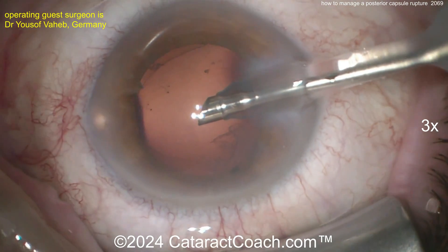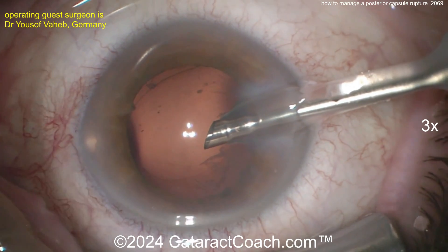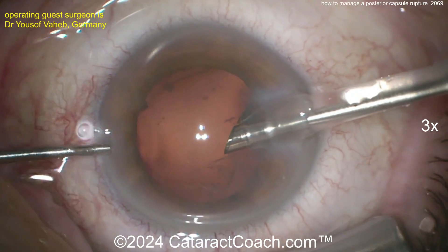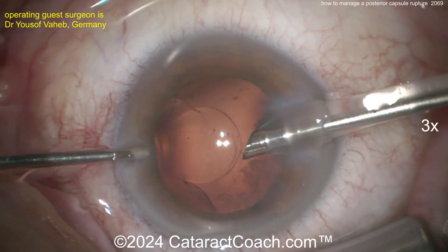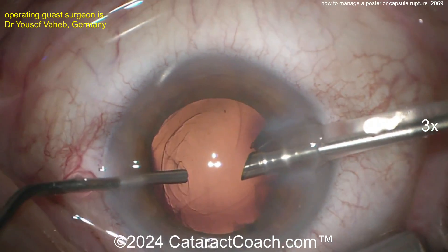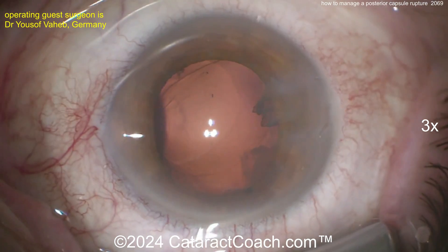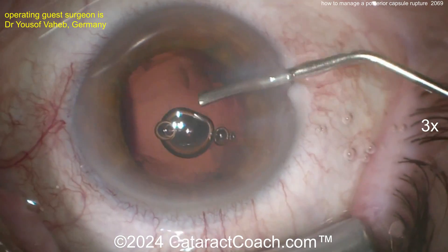Get the viscoelastic in the left hand and inject it — try to keep the vitreous at bay, keep the vitreous back. Injecting a dispersive agent here. You could use a cohesive, but the problem with cohesive is it'll come right out with the next little tiny bit of vacuum put in the eye.